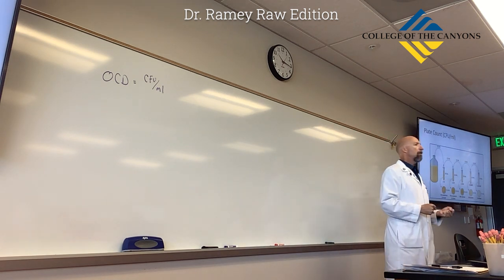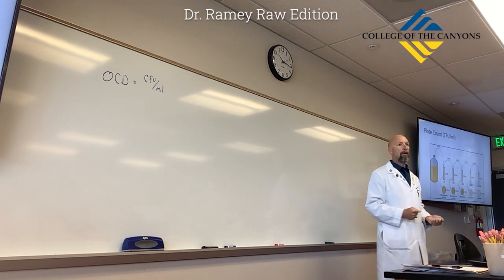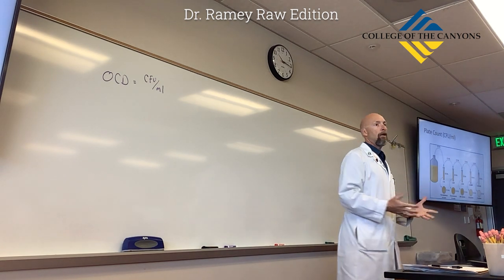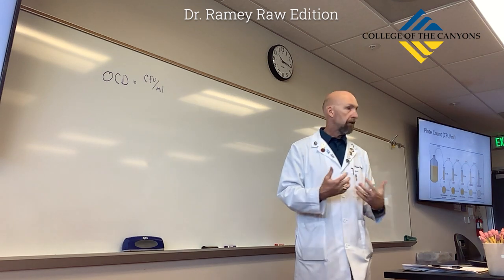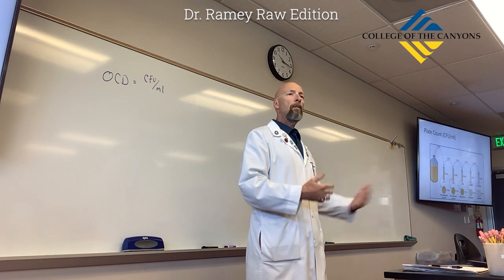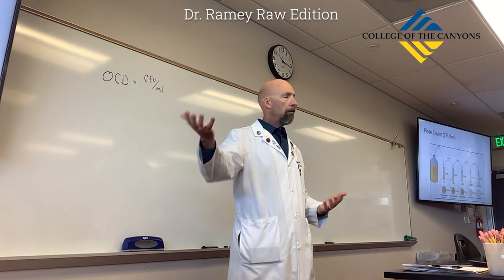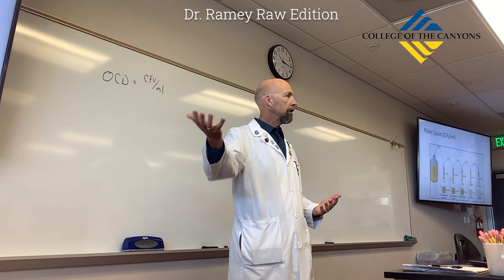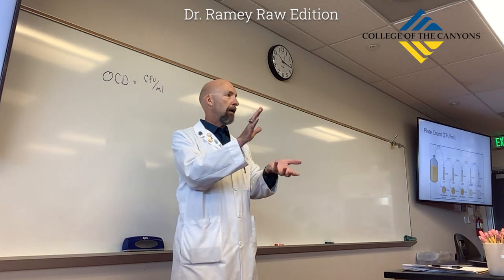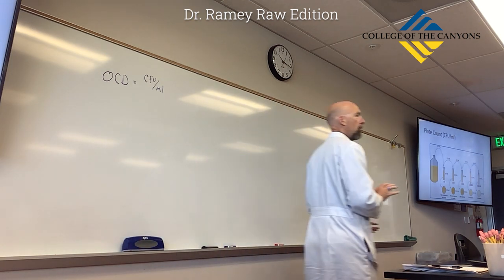what kind of information do you think is going to be important for you to determine and be able to report back to the attending physician? Especially if this patient has severe disease. I'm going to want to know what it is, but in addition to that, what the count is. That's not going to, not in this case. Knowing what the concentration of bacteria in a culture that you produced is not going to help your patient.